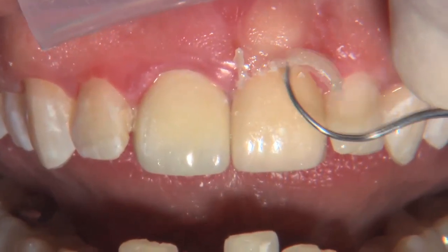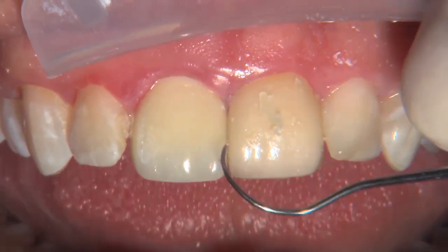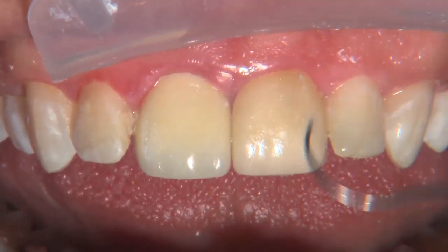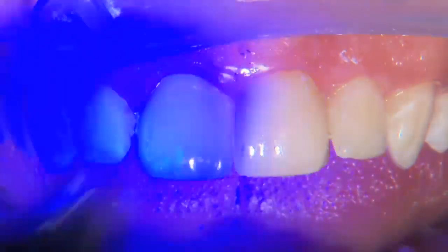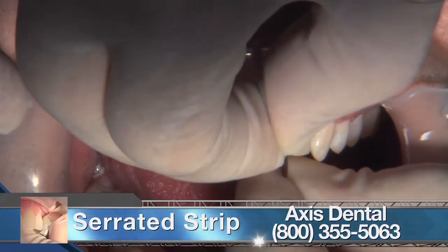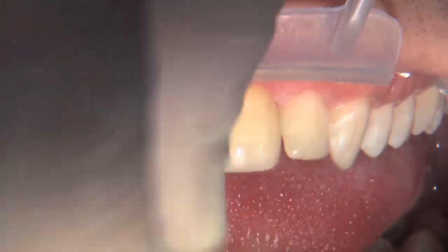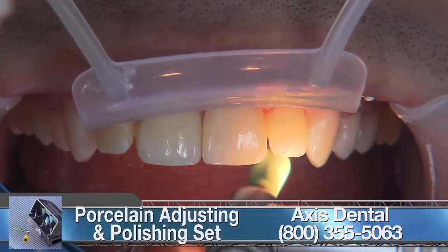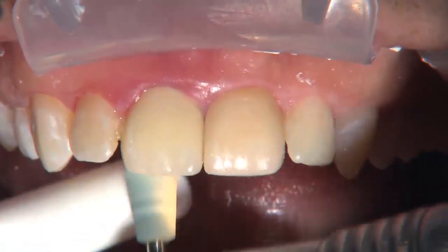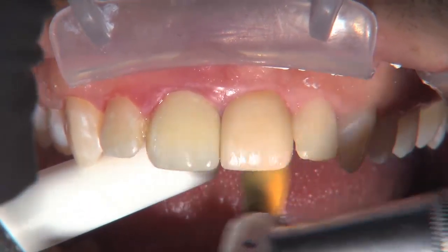The thickness of this is not going to affect the seating of this veneer — even with a traditional prep or minimally prep veneer, we'd do it the same way. You can see I've got a little bounce back on the gingiva; I want to make sure I get this nice and tight. Because of that bounce back on no-prep veneers, you'll often have to hold it in place as you cure it to make sure it doesn't move. On larger no-prep cases, the way these veneers float around as you're trying to seat them is something to keep an eye on — it's not the same as seating crowns or regular prep veneers where they just slide down into place. There's really no margin for the restoration to contact as it goes down, so they can move around and will often slide too far gingival.